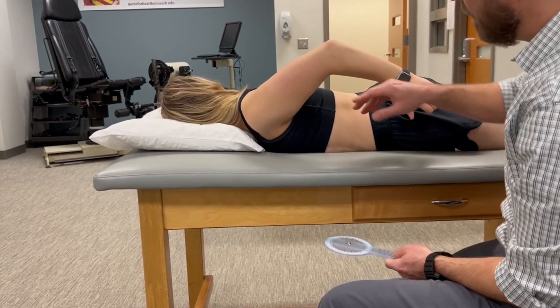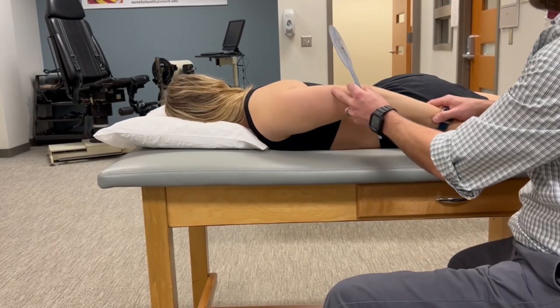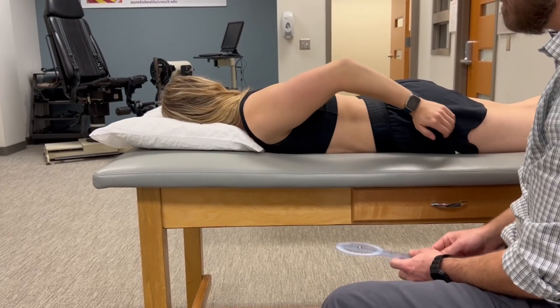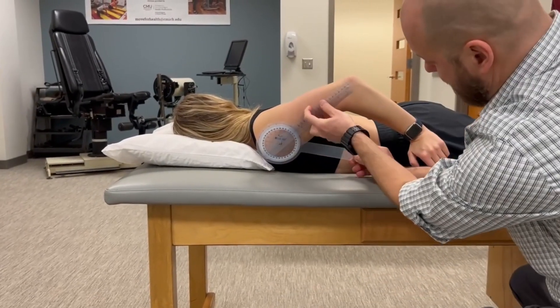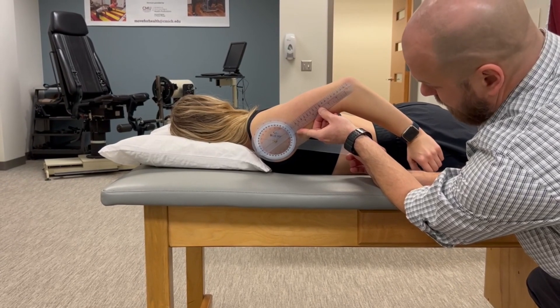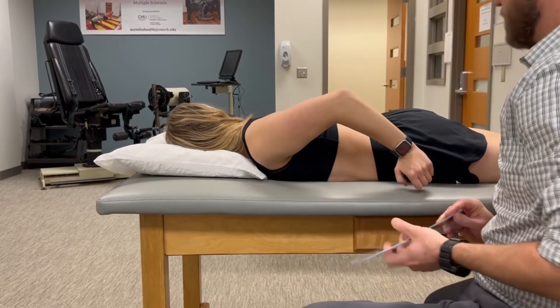Our starting position is going to be the humerus parallel with the lateral midline of the trunk. Go ahead and raise your arm up again. The reference arm is going to be parallel with the lateral midline of the trunk, and our indicator or distal moving arm is parallel with the humerus.